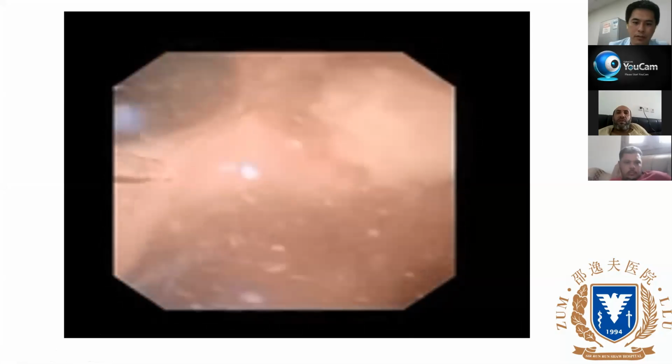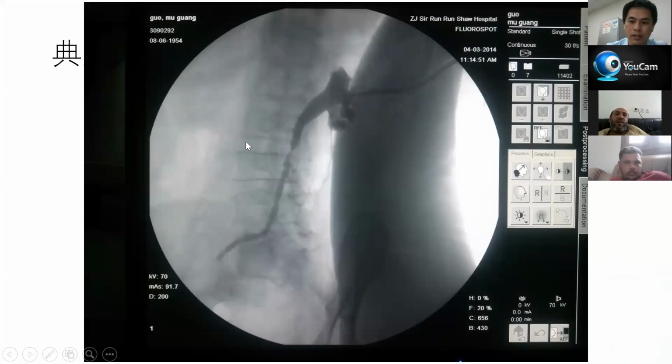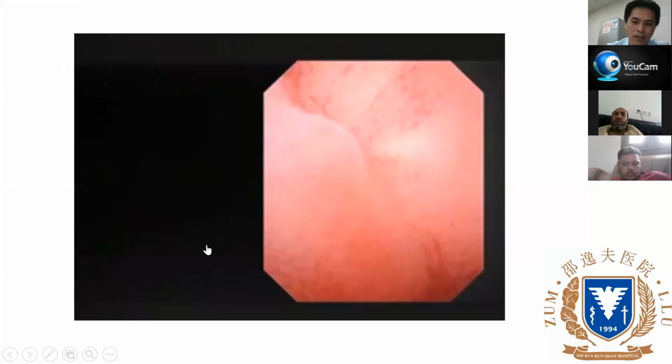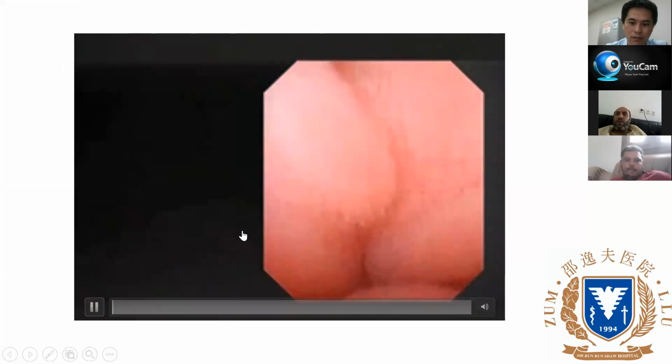Another case is a patient who underwent a bladder cystectomy and had the ureter placed on the side of the belly. You can see the obstruction here at this point. Then we do the surgery from the kidney with PCNL and from the other side using the flexible scope. Here's a very interesting video.